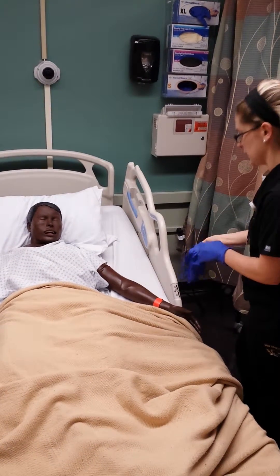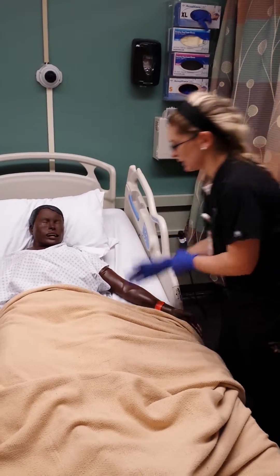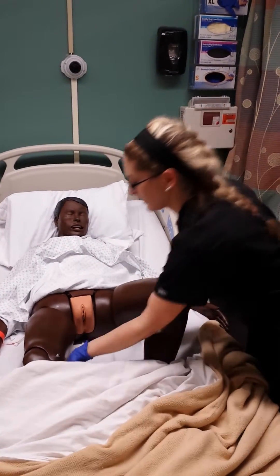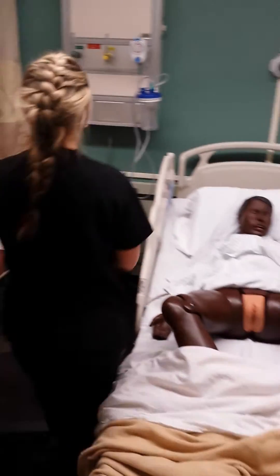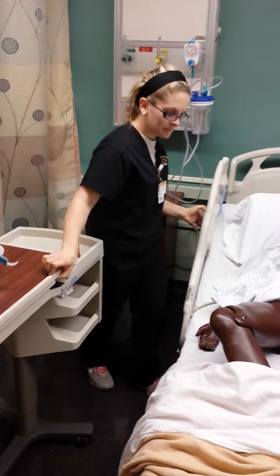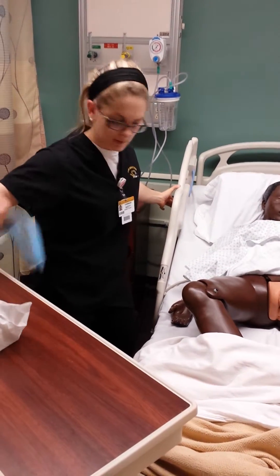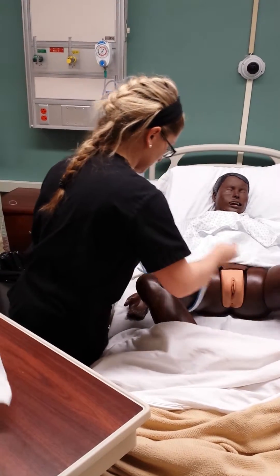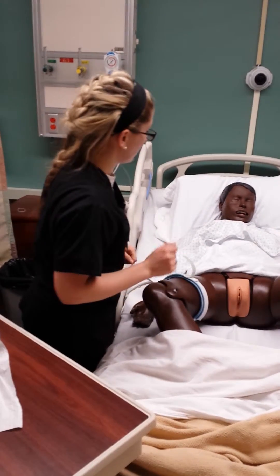Today we're going to insert a Foley catheter, which is going to be in place during your surgery to help the urine drain. I'm gonna go ahead and position your legs. This is going to keep your catheter in place during your surgery, so we're gonna attach this to your leg. Do you have any questions before we get started?